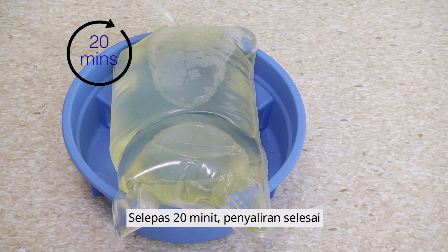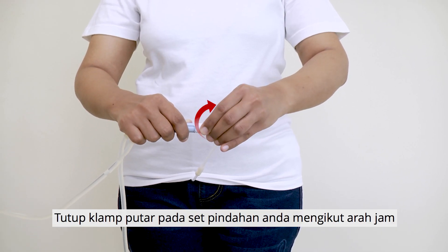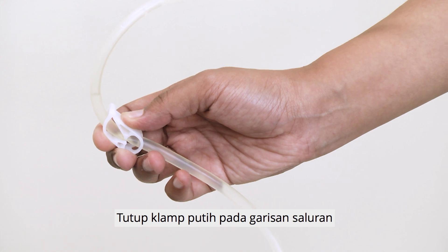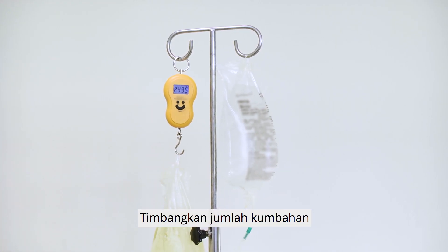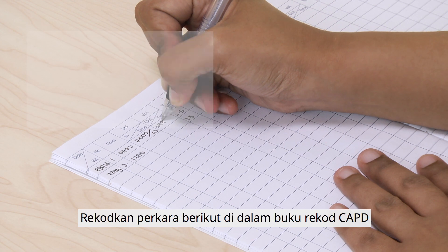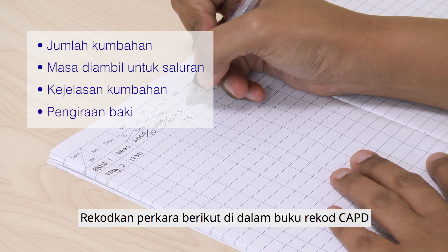After 20 minutes, draining is complete. Close the twist clamp on your transfer set in a clockwise direction, and close the white clamp on the drain line. Weigh the amount of drainage and check the clarity of the drainage. Record the amount of drainage, time taken to drain, clarity of drainage, and balance calculation in the CAPD record book.